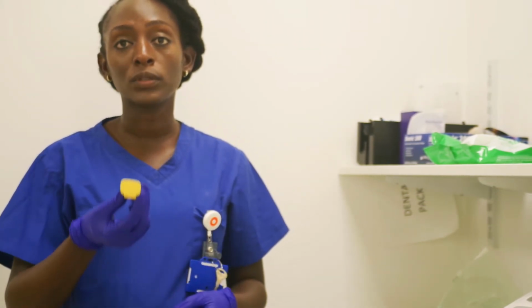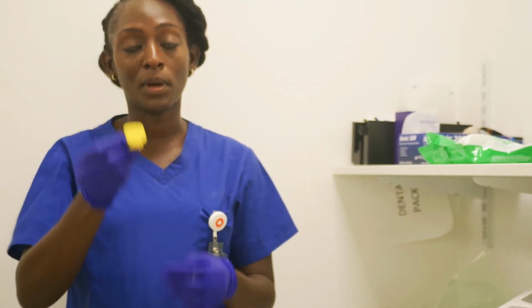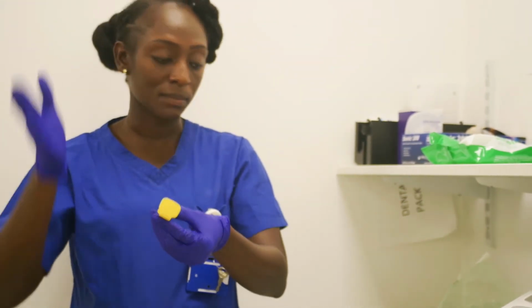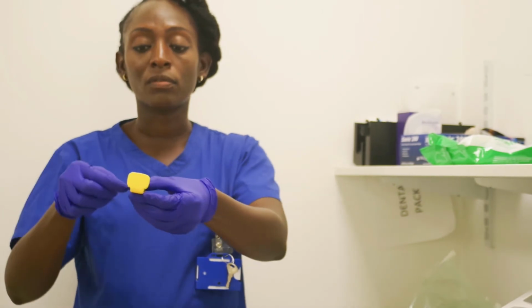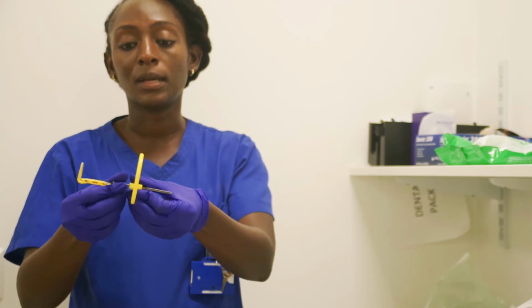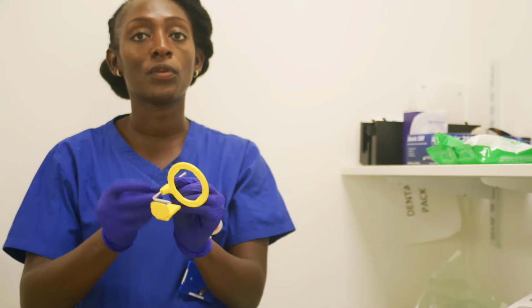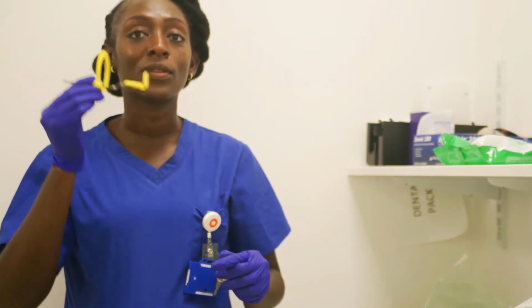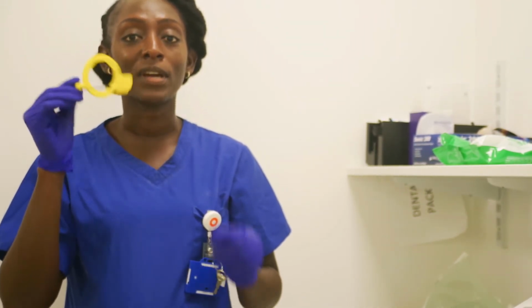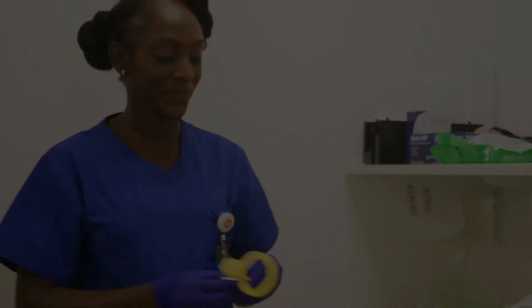Okay, so for an upper, you then have to hold the bite block up. This is for lower, this is for an upper. So let's say we're doing an upper right 6. So hold the bite block up, that's my right hand. Place this on the right side of the bite block, and then assemble the circular bit so that you can see your receptor through. And this would be for the right side. So that's my right side. So this is set up for the right side. It won't work for the left because the metal bit will be in the way.